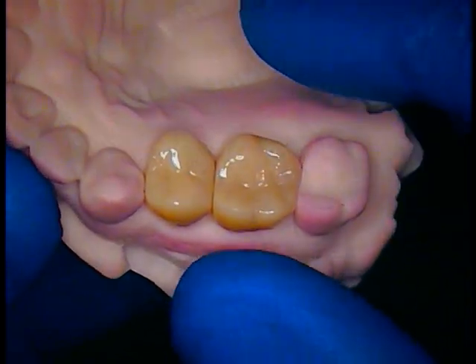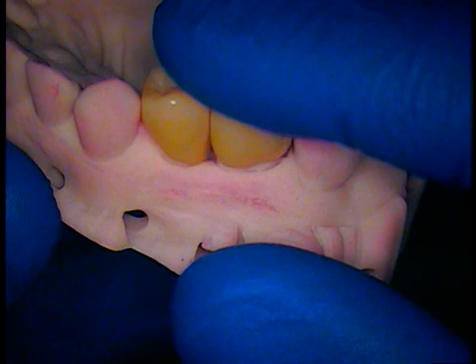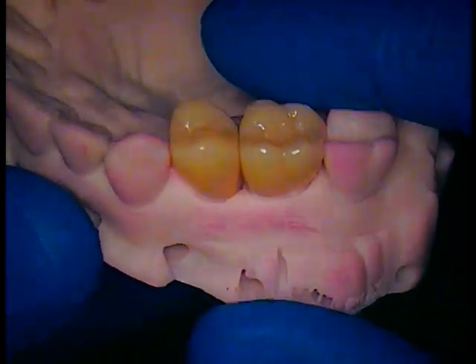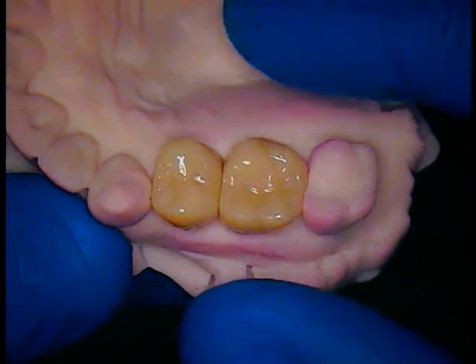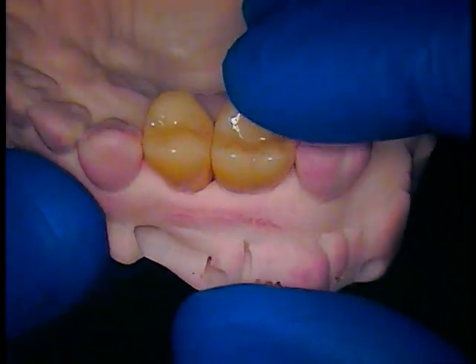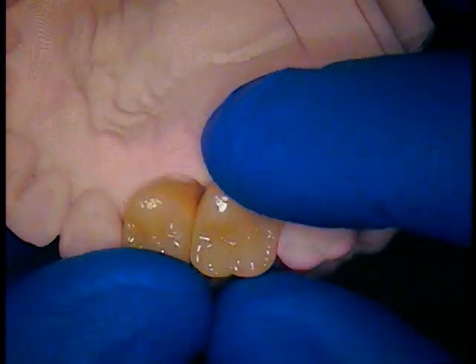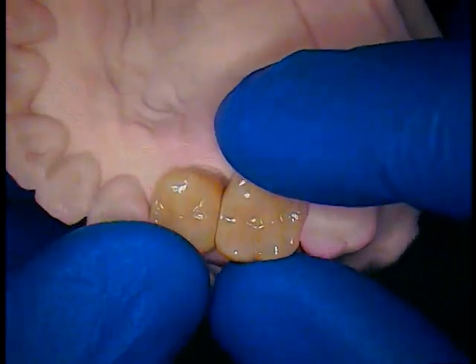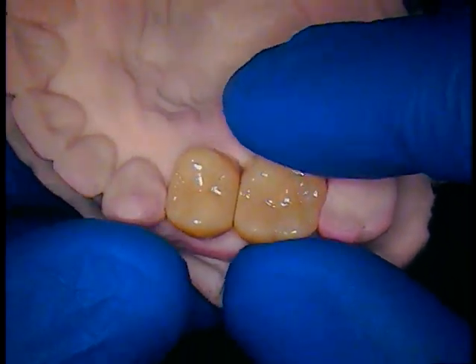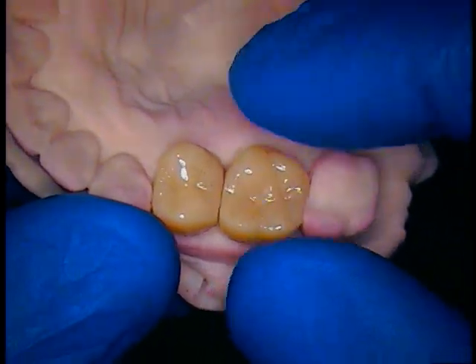We have two individual crowns going in. If you look very closely, you've got the very robust molar and the smaller premolar. Orthodontically, we've closed some spaces to make it better for the patient so they don't get food caught in between. The order will be the premolar first and then the molar.